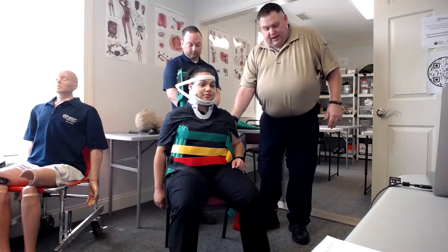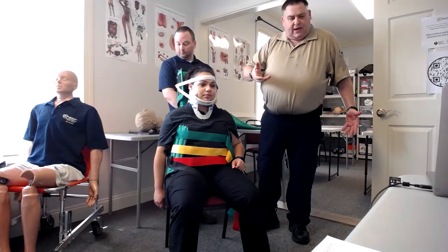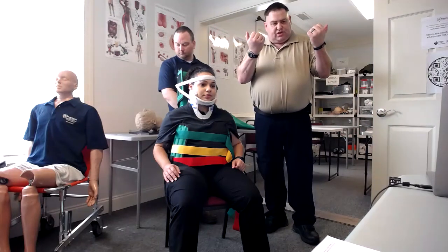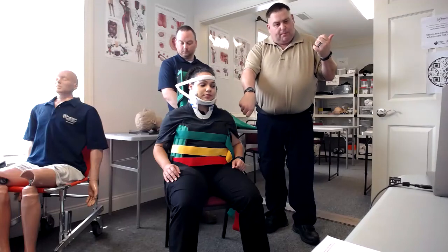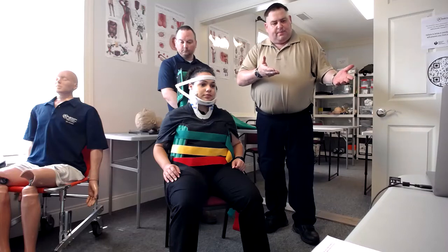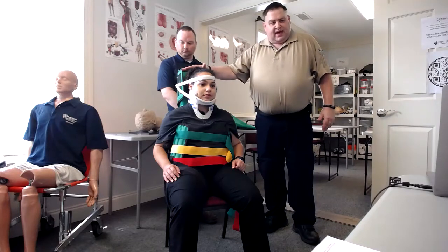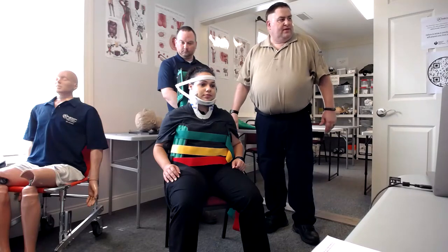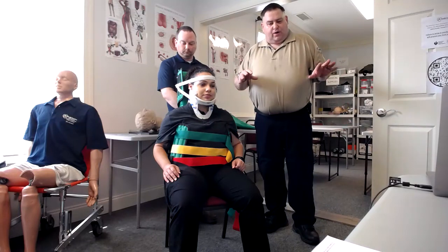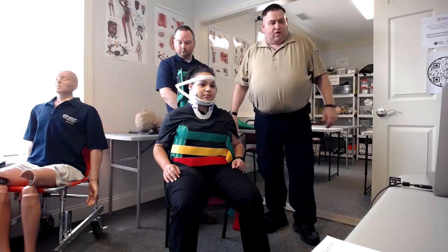Now she's secured. You have handles on each side and you can now safely rotate the patient and slide them out onto the backboard. Once they're on the backboard, their legs should still be in a sitting position. At this point, you're going to pop the thigh straps and allow the legs to be lowered down onto the backboard, and secure them to the backboard as you normally would — leaving the KED in place. Also check, again, your PMS — peripheral motor sensory and circulation — after all these movements.